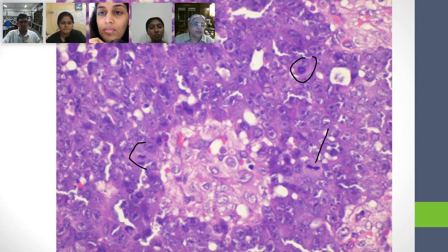Anybody in the chat box saying where the nuclear membrane has gone? You know that in mitosis, the first thing that happens is that the nuclear membrane disappears. What is happening inside, for all practical purposes, is happening in the cytoplasm. And if you ever see something that looks like a mitosis, but there is a nuclear membrane around it, it is not a mitosis. It's an artifact or it is something else.